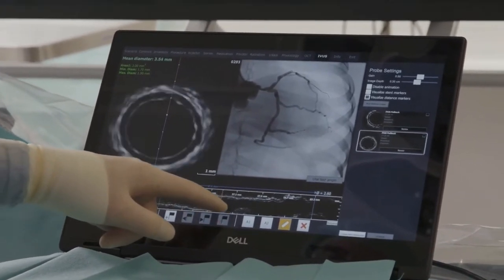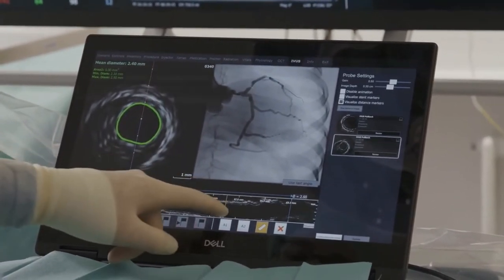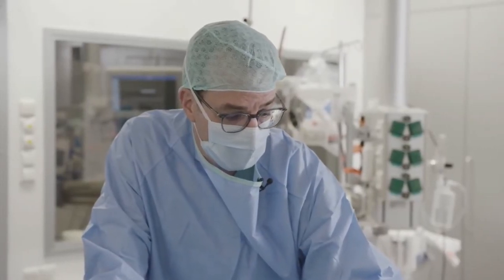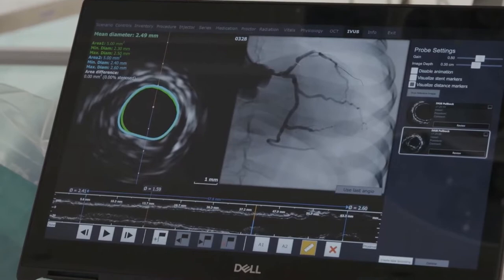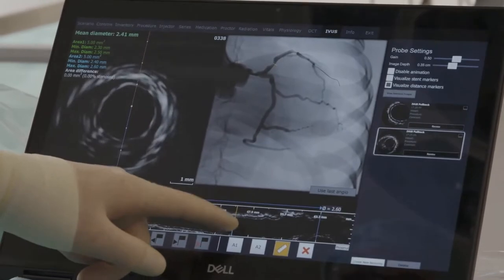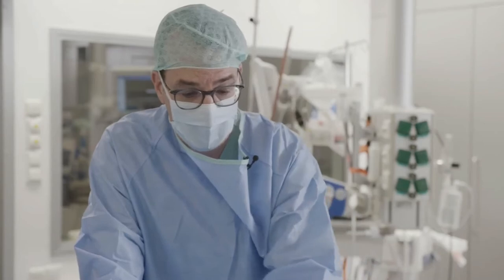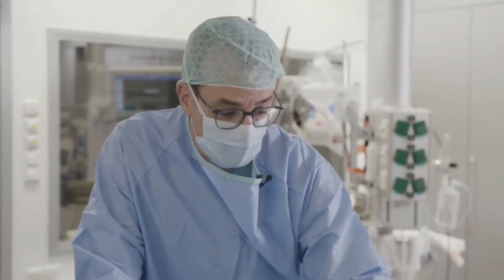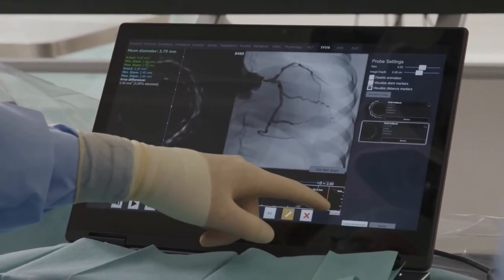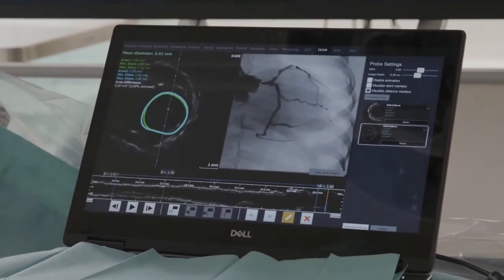And then we come to the proximal part. If we measure here, I guess we may be relevant. However, the area is 5.0 square millimeters, which, looking at the correlation of pathologic FFR with the MLA, is probably enough. And here comes the left main. This was already assessed by the IVUS from the circ.